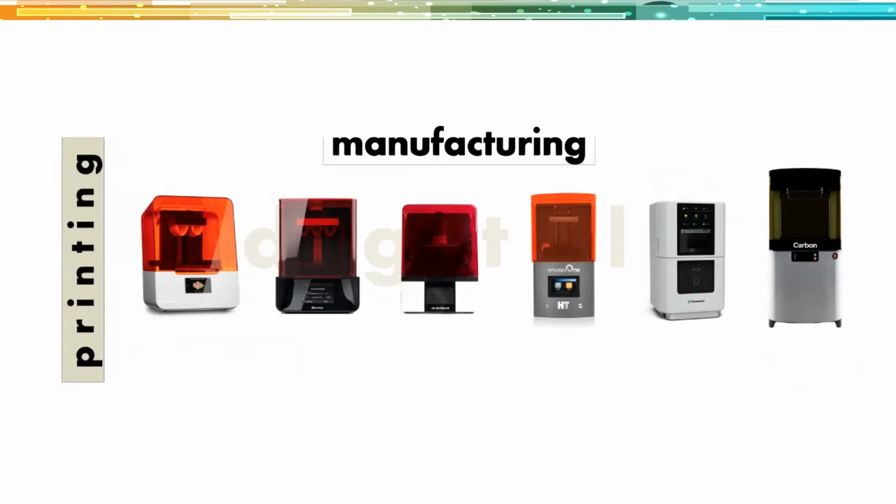And the way that we can categorize 3D printing today is basically by the general price point. And so the two printers on the left would be considered kind of the value segment of 3D printing. I would say, anywhere less than $6,000 or $7,000 to get started. The ones in the middle are going to be kind of the mid-level printers, and those are typically going to be between 10 to 15,000, and the ones on the right can be even more and are used in laboratories for high production scenarios.